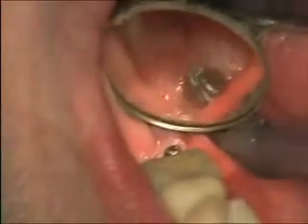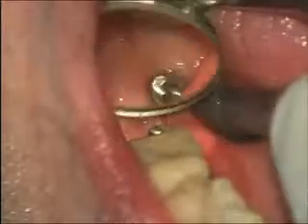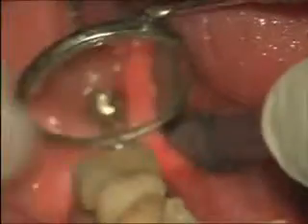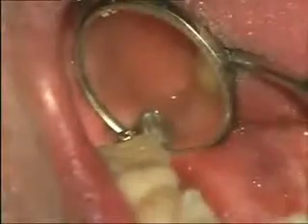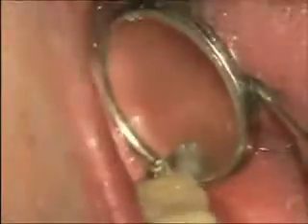Can you see that? My finger pressure. Now I want to connect the abutment to the implant. Now all implant systems that you have worked with, you need to have a screwdriver. You need to put a tiny screw like this. So I will take this abutment beater, I will place it like this — 1, 2, 3, finished.